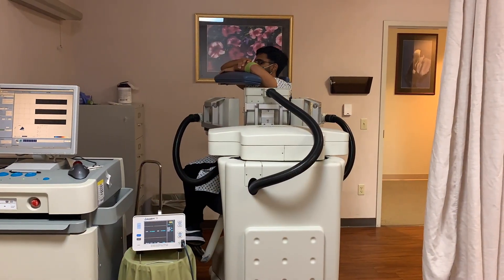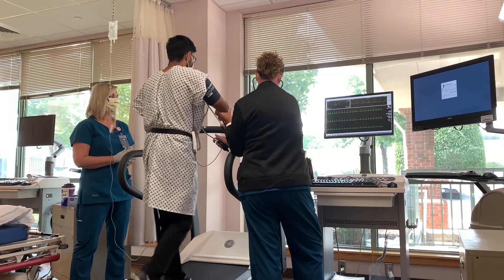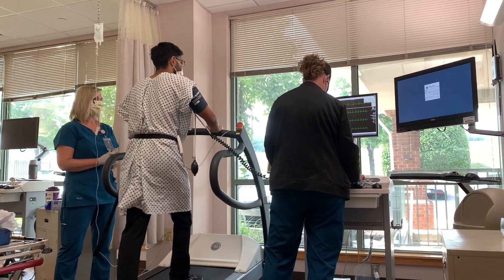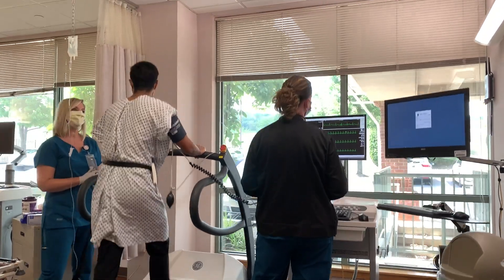You will get a special scan of your heart after being injected with a radioactive tracer at rest, and get a second scan with injection of radioactive tracer after increasing your heart rate. This test can last approximately 3 to 4 hours.